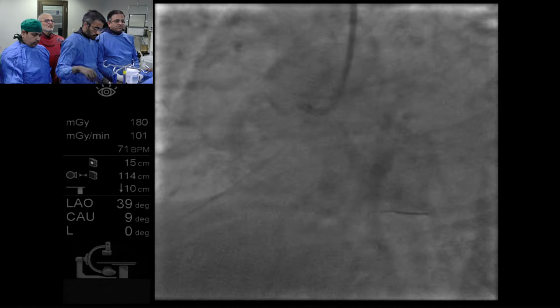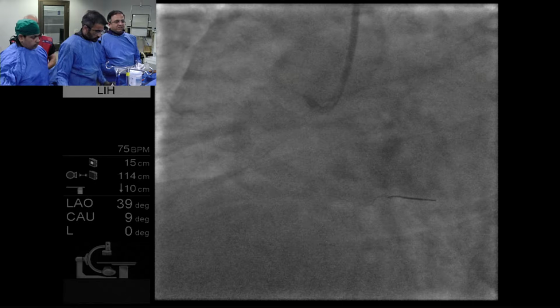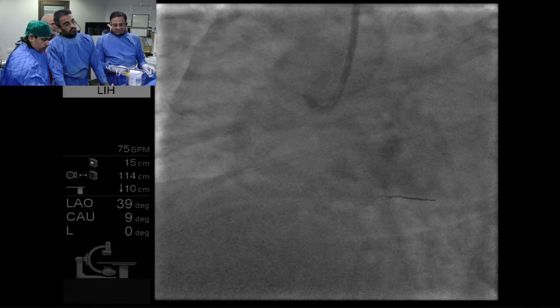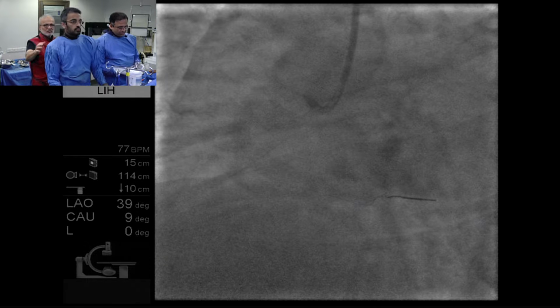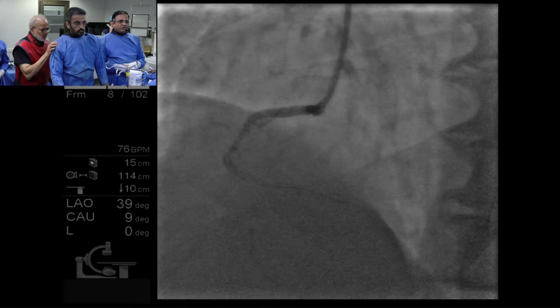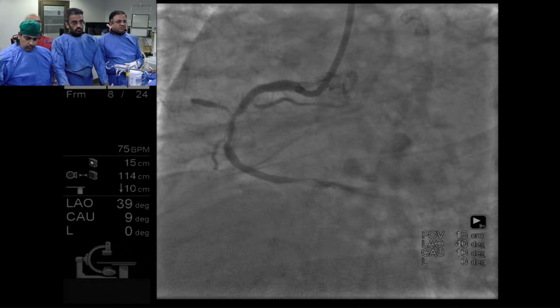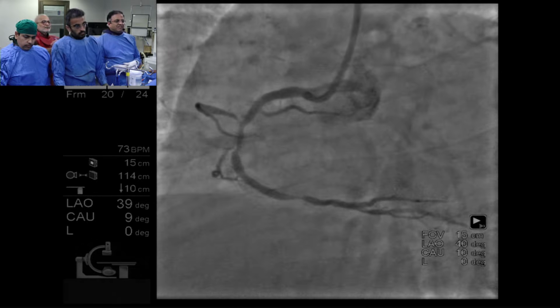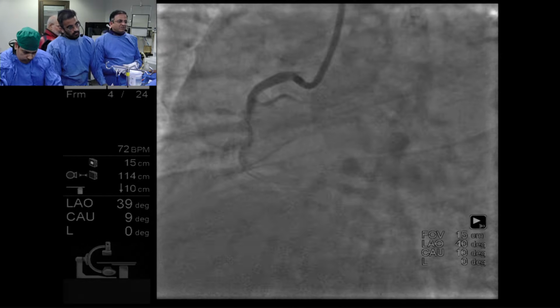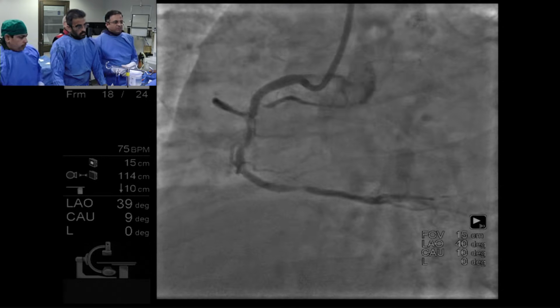So what is the plan, sir? We're going to first dilate the distal and the proximal lesions. Then we have two choices. We can either OCT everything and then stent, or we can stent the distal first, which looks like a fairly focal, straightforward lesion, although there is no such thing. And then we want to come to the more complex part of the procedure, which is the in-stent restenosis. So what does the panel think?